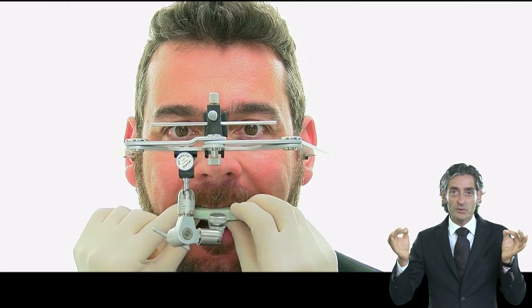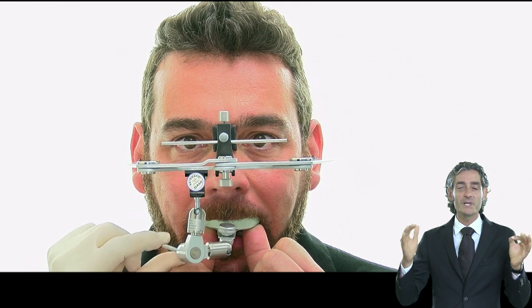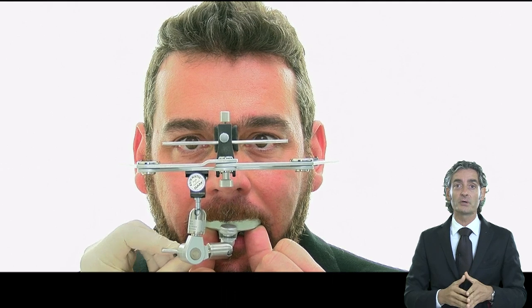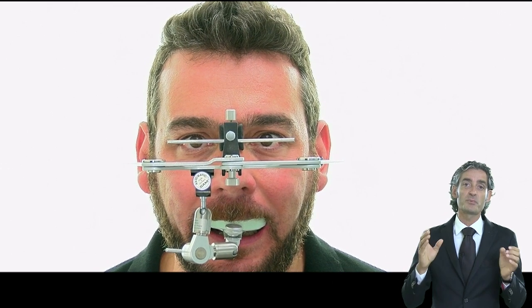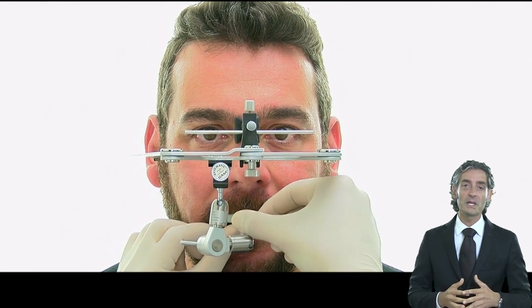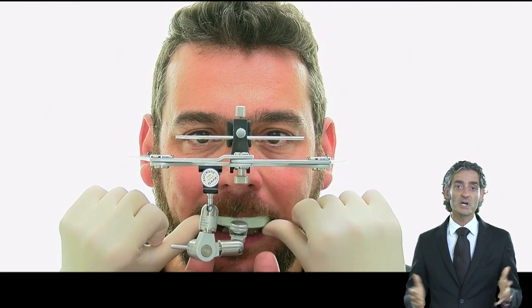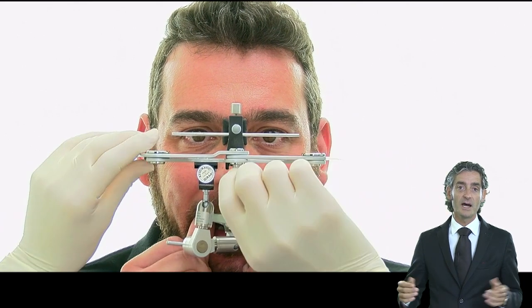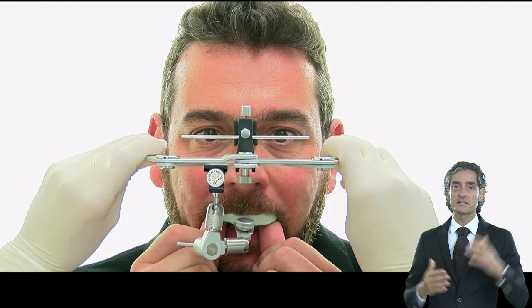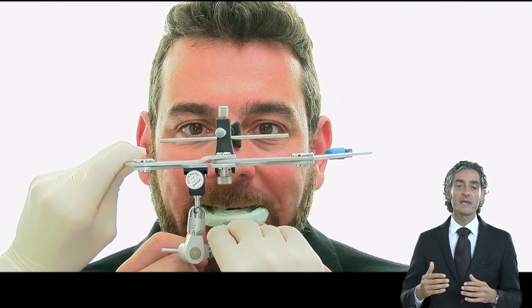But in any case, if you give the face bow to him, it's really easy because he can assess the inclination that the patient has already on the articulator. And then if you ask to move something, he can understand precisely what the situation is. It normally takes 1 minute, sometimes less. And as you can see here, after we fix everything, we check with our horizontal reference, in this case the bipupillar line, and then we take it out and everything is done.